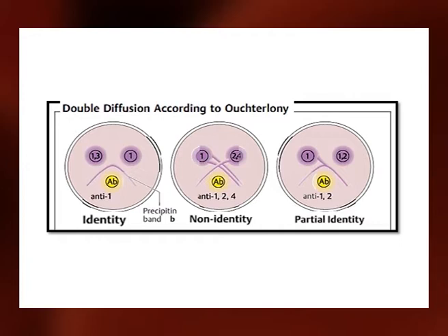The precipitate can be stained, enhancing its visibility to aid the observation. A single assay can compare more than one antigen to determine whether the antigens in question react the same way or differently with the antibody. This method is sometimes used to determine whether samples have come from the same or different origins.